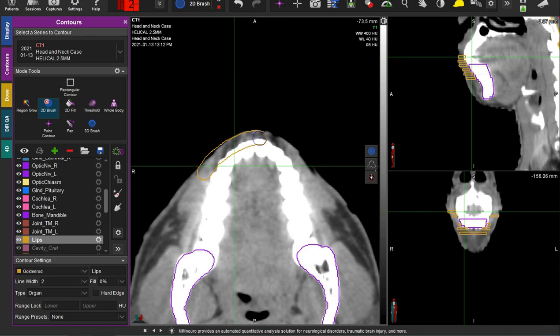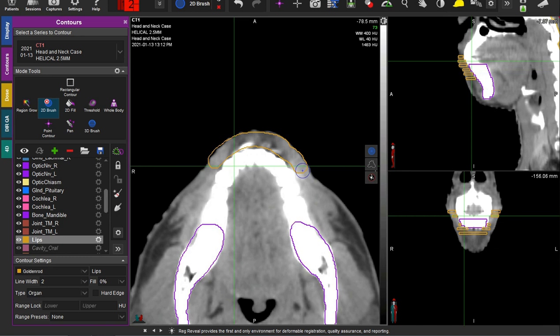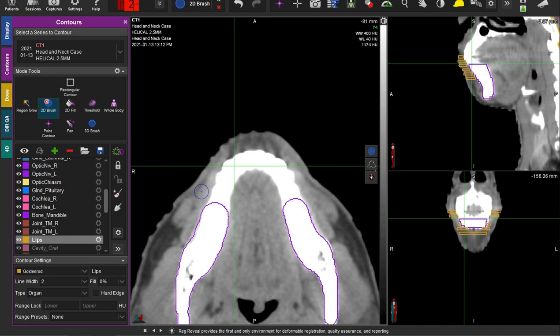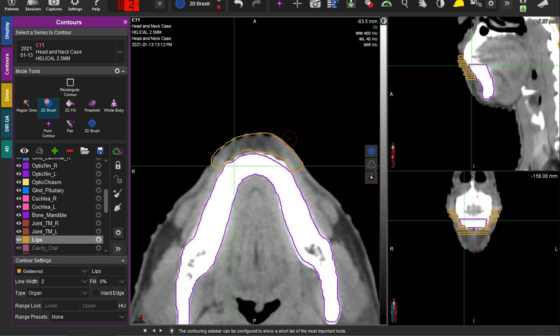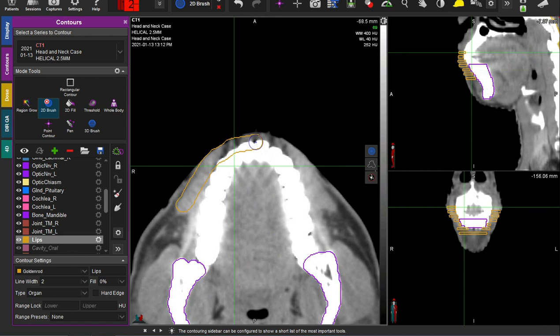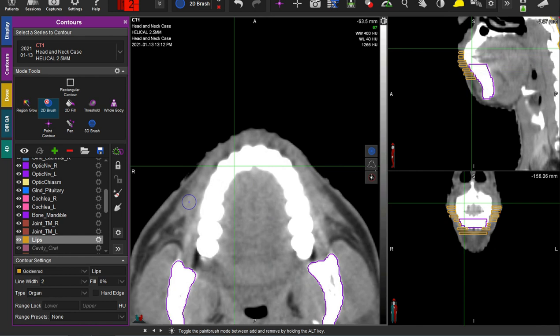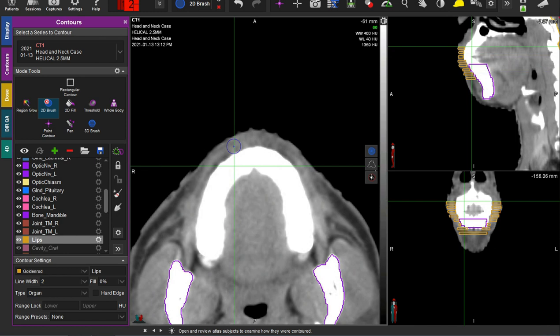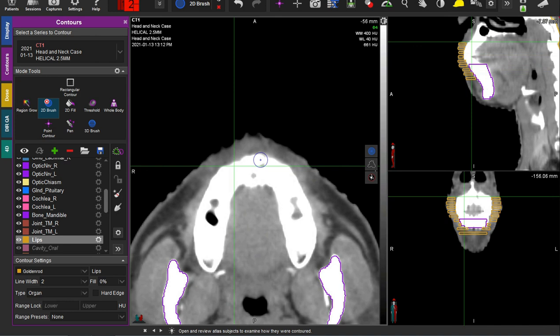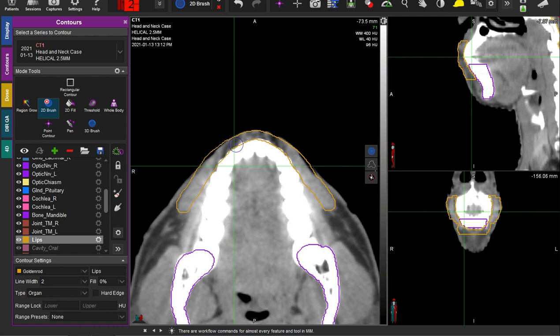You carve out the air in front and the bone in back. As you get closer to the smile the lips are going to get wider. I've seen lots of heterogeneous lips — this is not the most important structure to contour perfectly, but here you can make a pair of acceptable lips. We're now on the upper lip. This case was easier to draw because the patient had their mouth closed. Note that when the patient's mouth is open, the lips may be divided with a black space where the lips are open. I'll interpolate, then smooth the lips a little bit and carve out some of the bone.